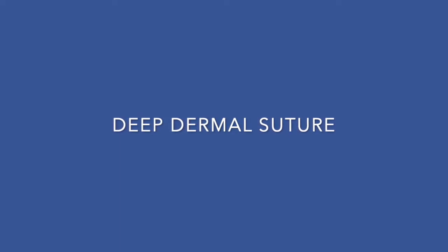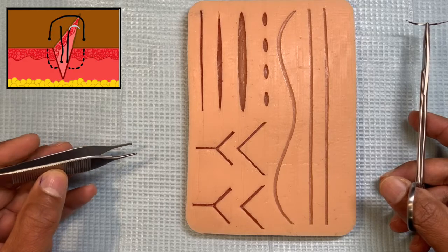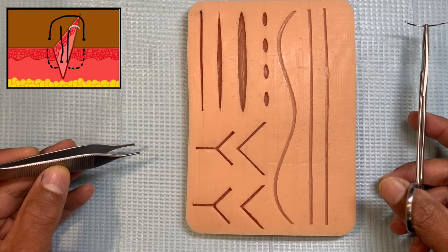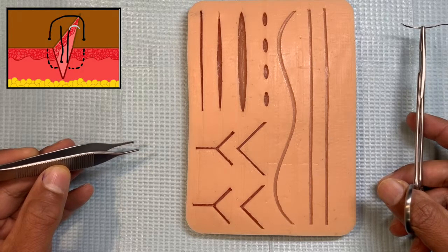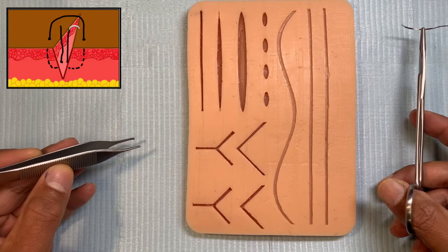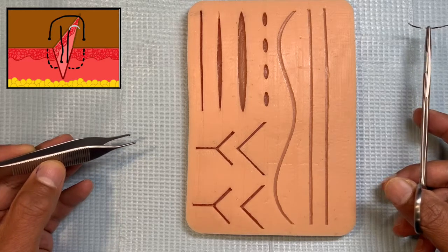This video is about the deep dermal suture. This is an important suture to learn because for any deeper wound you want to support the dermis. The dermis itself is the strongest layer of the skin and once it's well approximated then the cutaneous closure will hold really well.